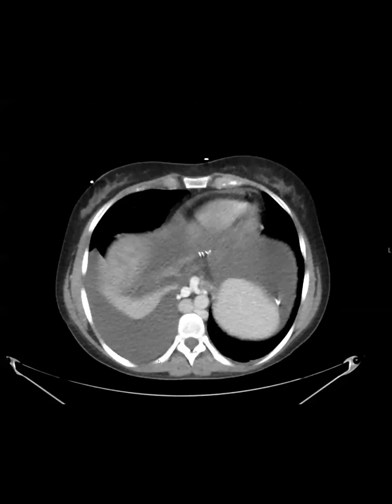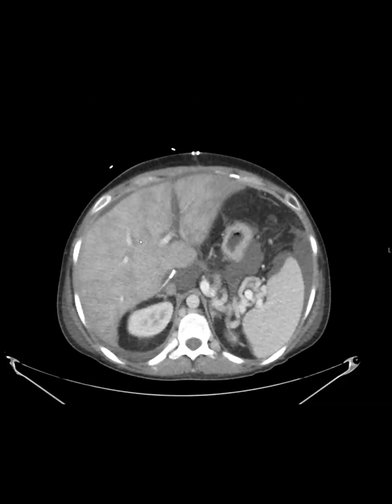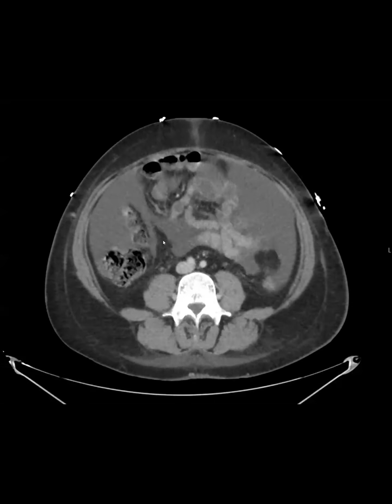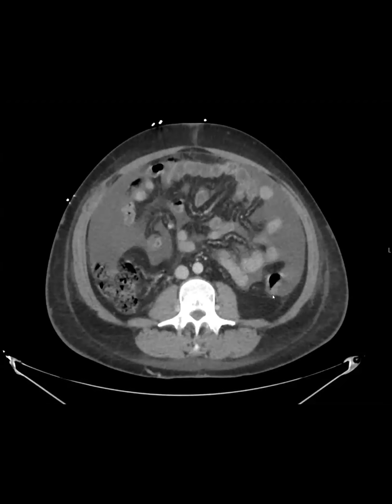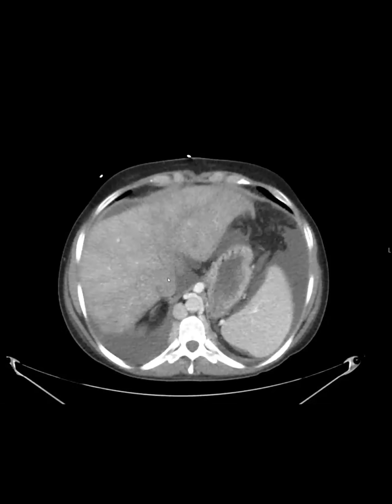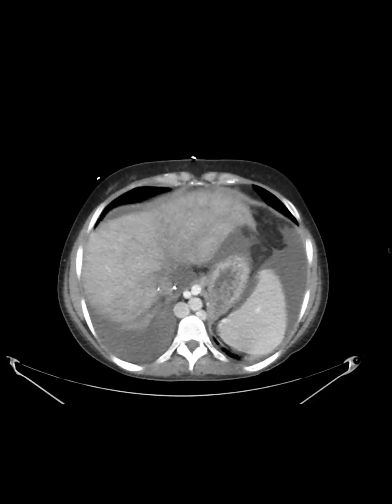And you can see actually they now have effusions and refractory ascites, and they've got a congested appearance of their liver. So then they said, okay, we want to see if our shunt is working well, because we had to create the shunt on the table. So can you tell why there is refractory ascites? We're worried about the shunt, whereas they were sort of well compensated before.